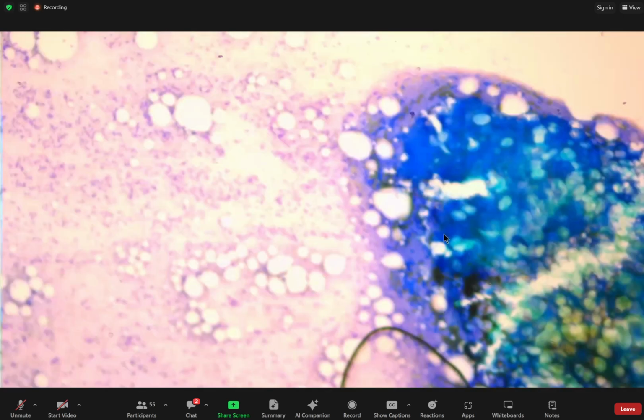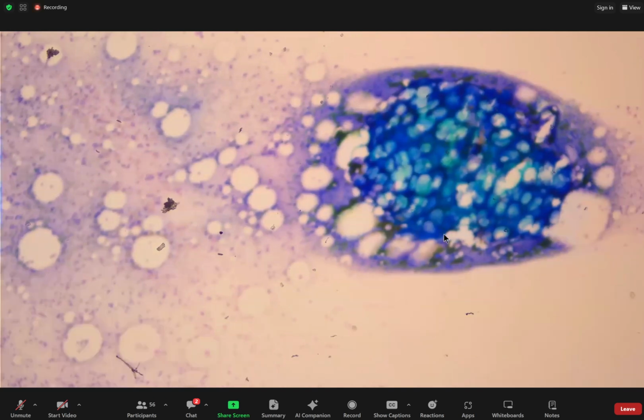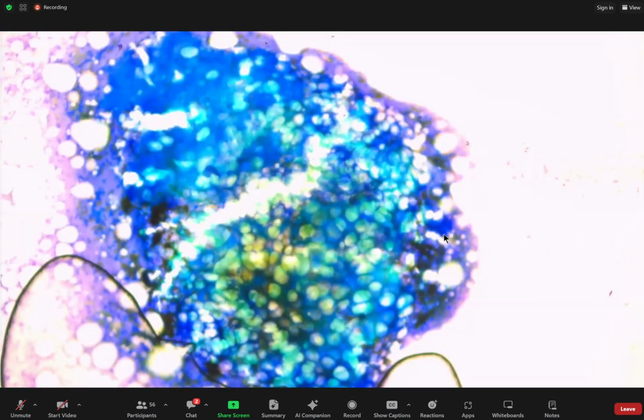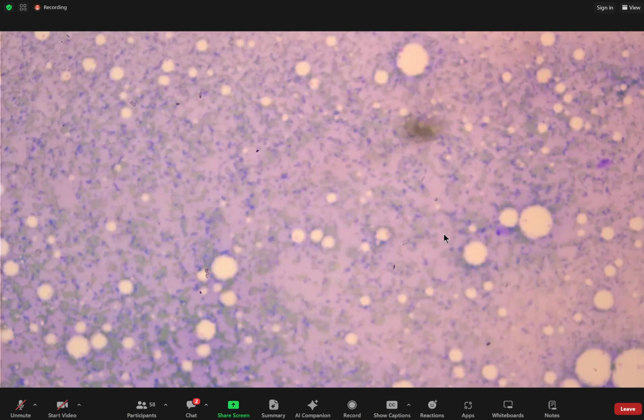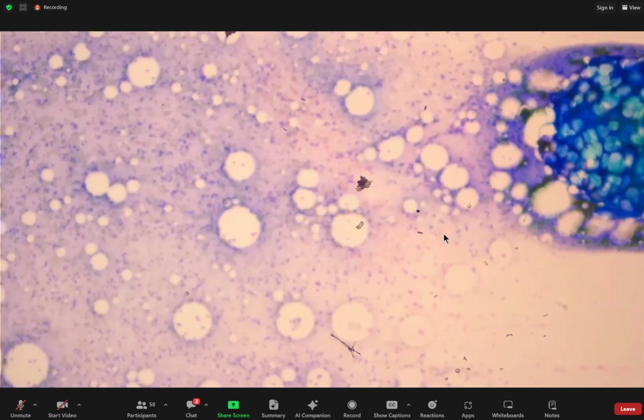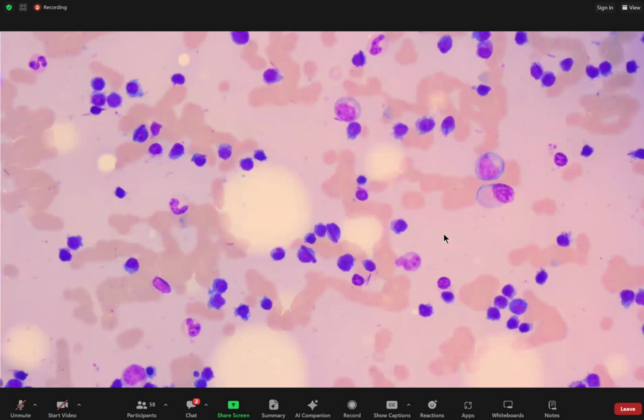So this is the bone marrow fragment. This patient is 59 years old, so it is hypercellular with partially hemodiluted cell trails, but the cell trails mainly consist of these abnormal cells, most of which have eccentric nuclei, and we can see intracellular inclusions, Auer rod-like, and also the extracellular rods.